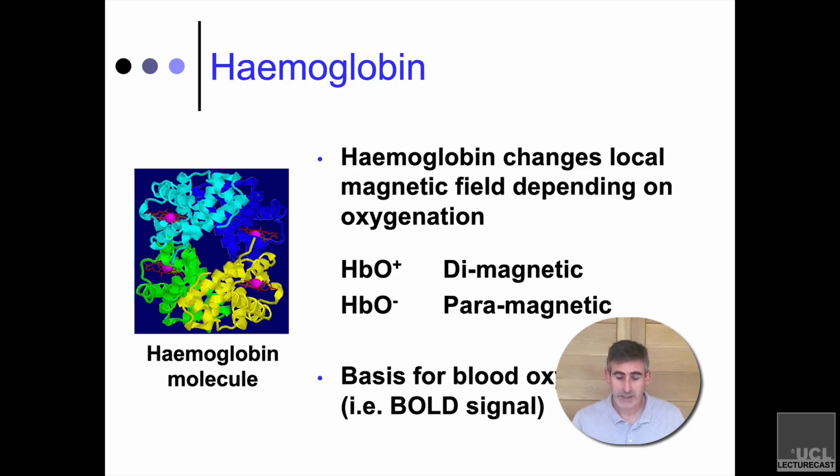When you put a human being, or an animal of any sort really, into an MRI scanner like this, the iron molecules that are not bound by oxygen in the hemoglobin act like little magnets, and they distort the magnetic field, exactly like the paper clip does when it's touching a bar magnet. When they're covered up by 2 oxygen molecules, they're essentially hidden, and therefore the iron doesn't affect the magnetic field. I said earlier that the frequency gives you information about the space, right?